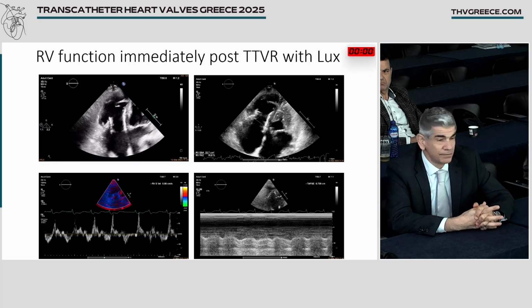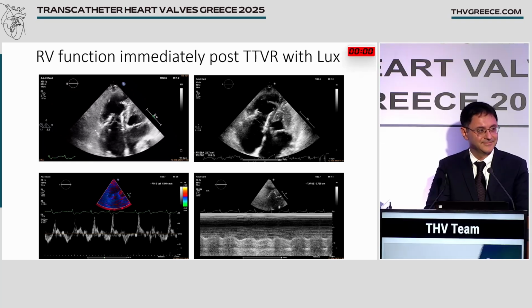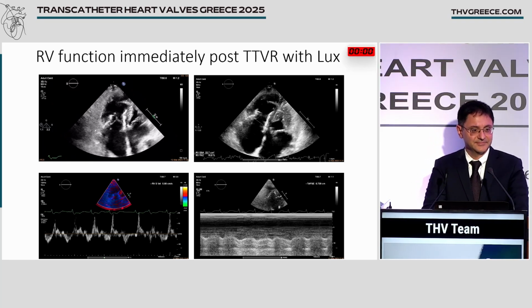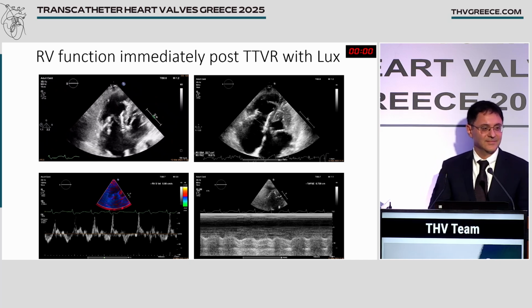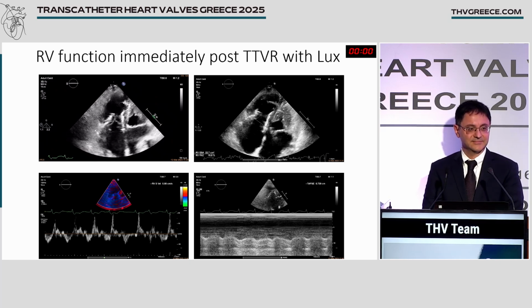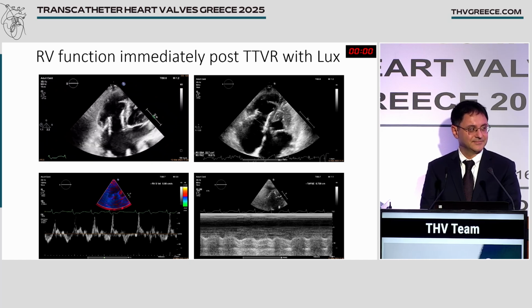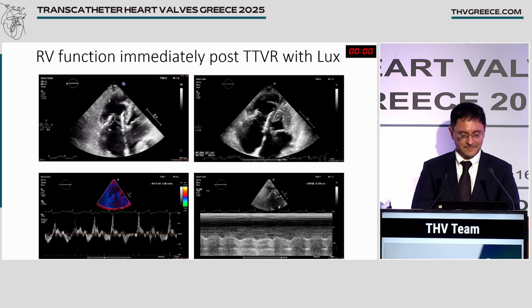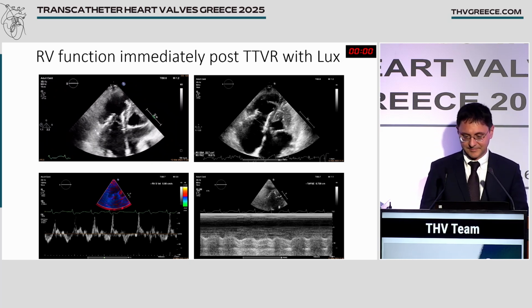Congratulations, really. We watched 3 important tricuspid valve replacement cases, and I really want to congratulate the whole team, Professor Spargas and his team. So, do you want to add some comments? Okay. What was the mean gradient? The diastolic gradient of the valve was low. It was 1.